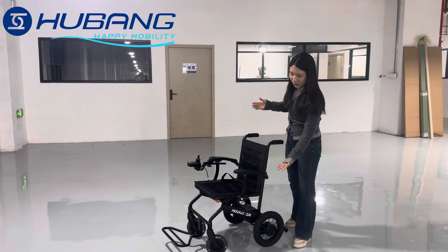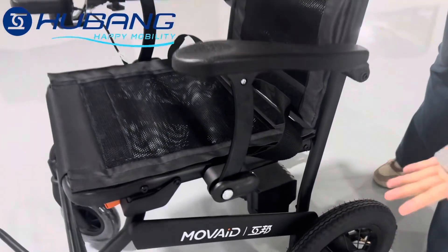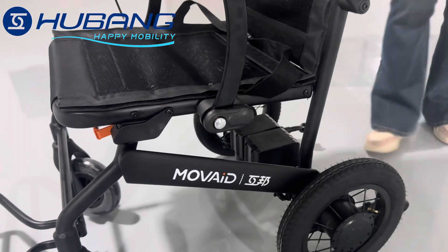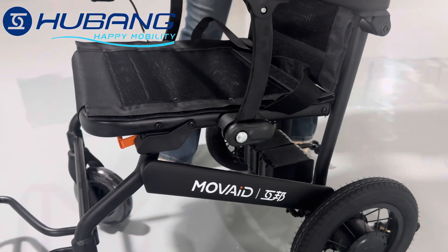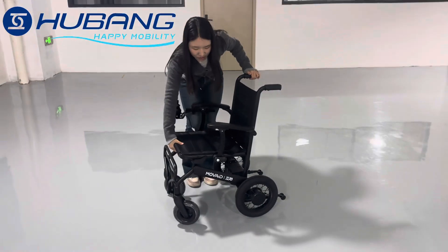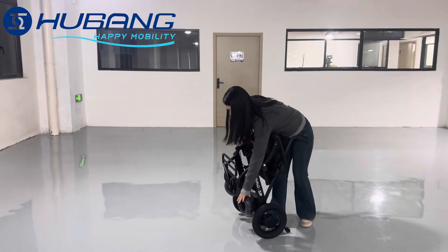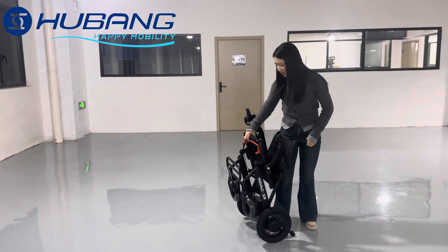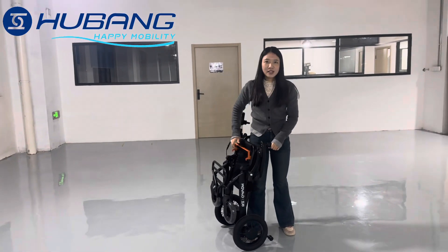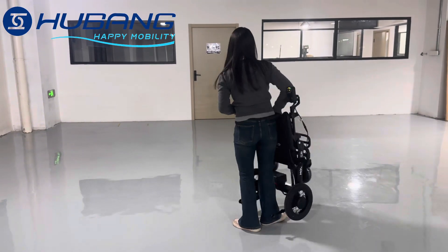And regarding the look, we've made sure it looks great too. The design is sleek, modern and lightweight. It only weighs 12.5kg — that is 27 pounds — thanks to the carbon fiber construction. So you don't just feel comfortable, but also look good while you are moving around with the wheelchair.